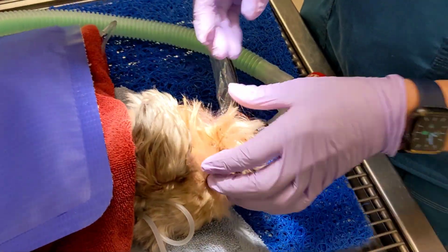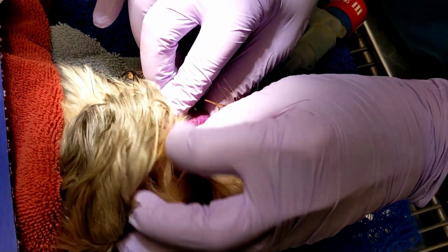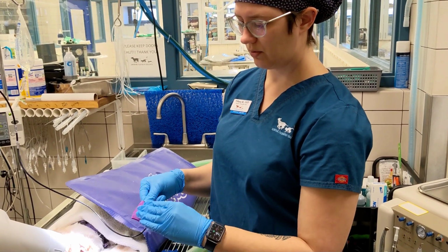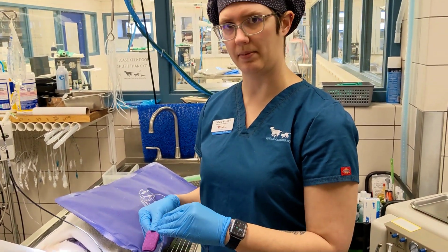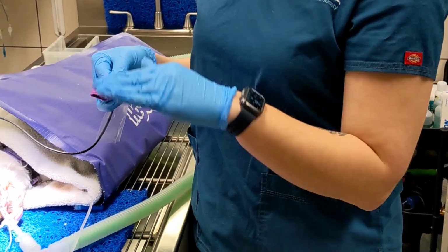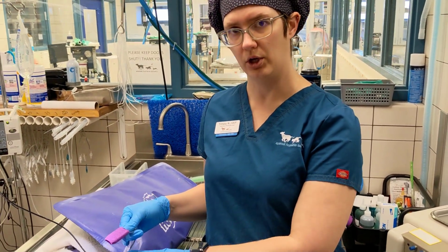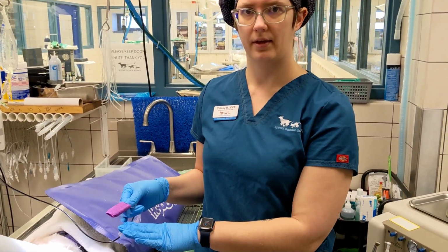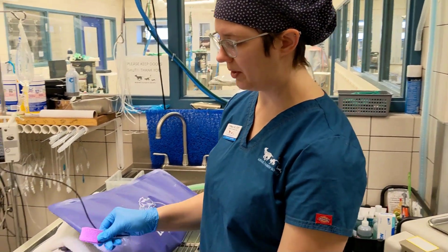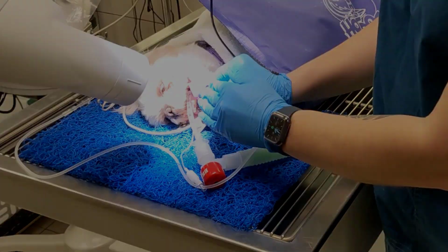Now I can't just take it straight down because then I'm going to go all the way through those teeth, right? So I'm going to have to take this at an angle. To get the proper angle, it's this plate that you want to get that proper angle with. So if you're aiming for a 45 angle, it's a 45 angle to the plate. If you're aiming for a 60-degree angle, it's to this plate. Unless the animal is completely parallel with your surface, like your table, then that would be your 0, but that's often not the case. So wherever that plate is in the mouth, that's your 0. You need to use that as your plane of reference.